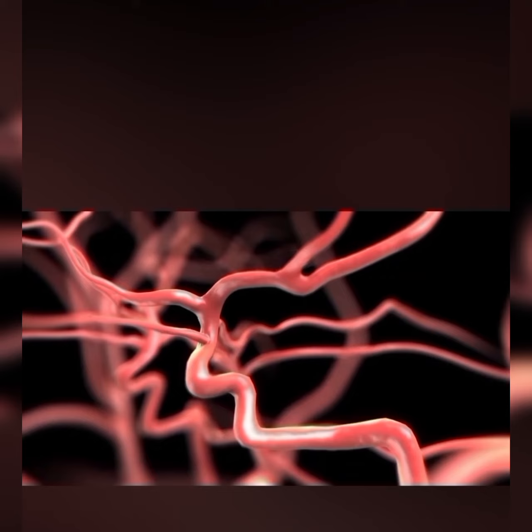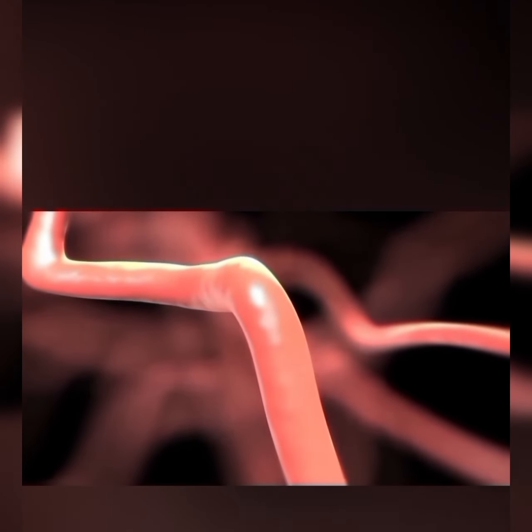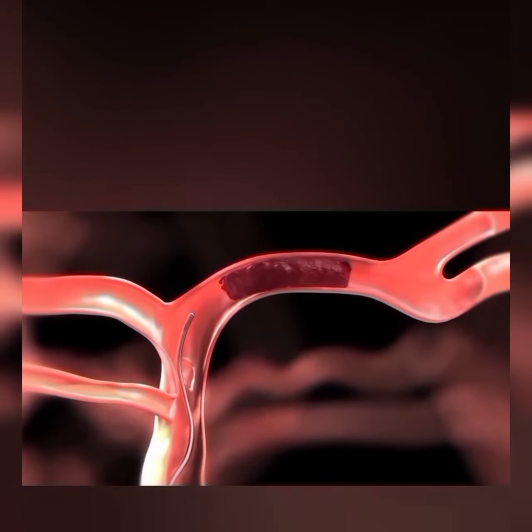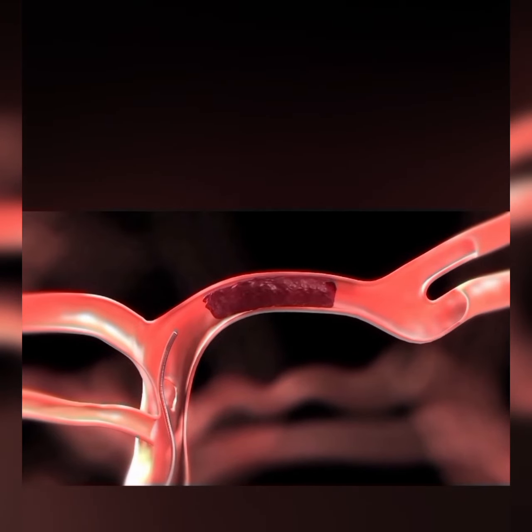In situations like this, we can intervene. We can go in from the femoral artery in the leg with a catheter, as you can see here, and place it in the carotid artery in the neck, that's the blue catheter. Through that catheter, we take up a smaller catheter, a microcatheter, and we catheterize the arteries inside the brain, the carotid artery, and then into the middle cerebral artery. You can see the clot within the middle cerebral artery, which supplies blood to that half of the brain.